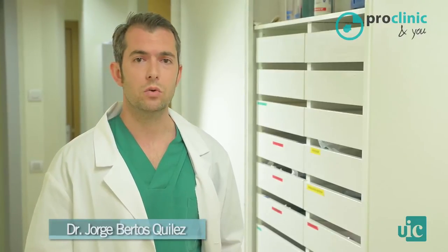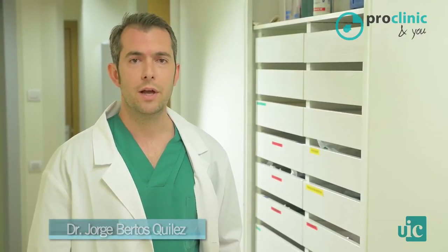Implantology is the branch of dentistry that involves the replacement of the missing teeth that the patient has lost during his life. We can replace them through artificial dental roots called dental implants. Implant designs have evolved considerably all these years, and nowadays, the most used are the ones which have a root shape, are made of titanium, and are screwed to the bone. We can offer a good, reliable, and long-lasting solution that helps to recover the masticatory function that had been lost.